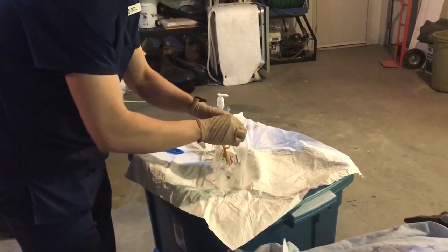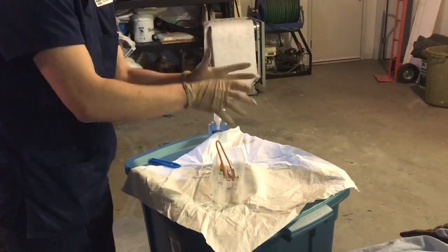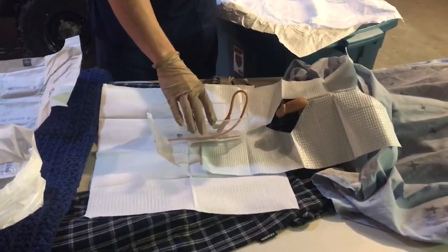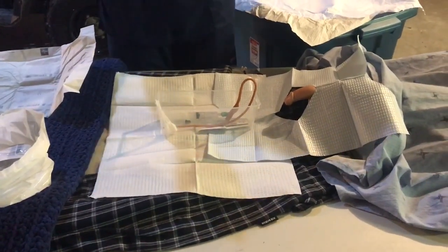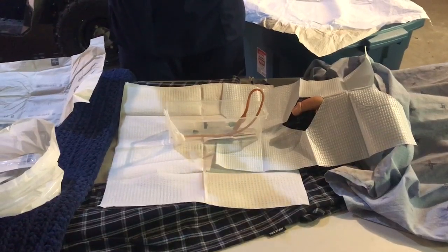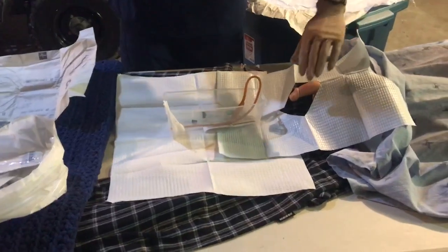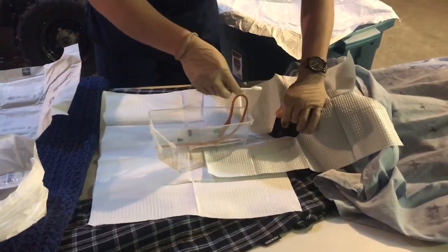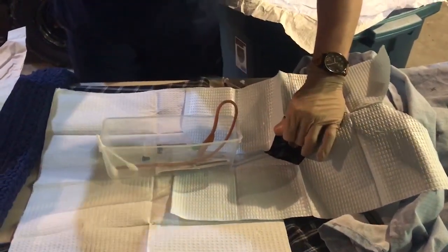Alright, once that's done, I'm going to move our tray between the patient's legs. So once that's done, I'm going to note that our patient is circumcised, so we don't have to worry about retracting the foreskin. So I'm going to grab the shaft of the penis and clean in a circular motion from the meatus to the base of the glans.